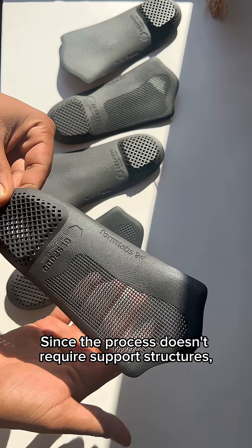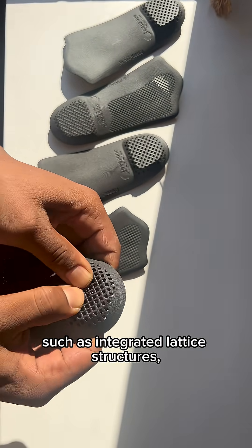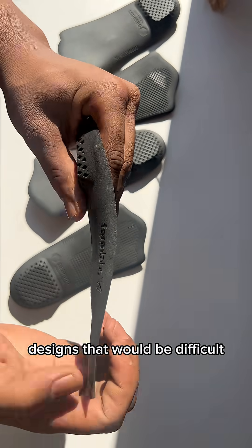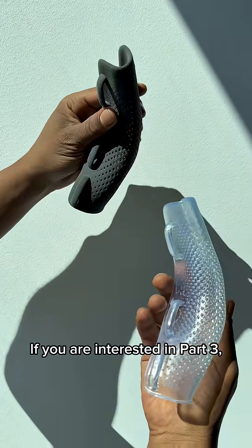Beyond material performance, SLS shines in terms of design freedom. Since the process doesn't require support structures, it enables complex geometries such as integrated lattice structures — designs that would be difficult or even impossible to achieve with other manufacturing methods.